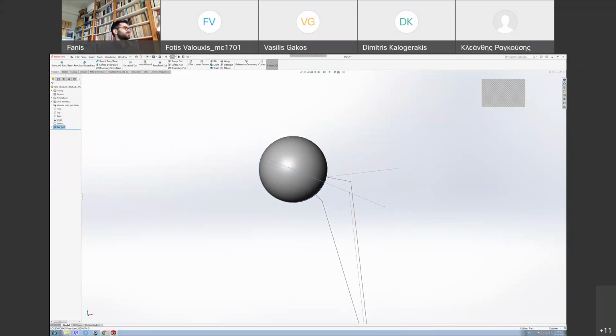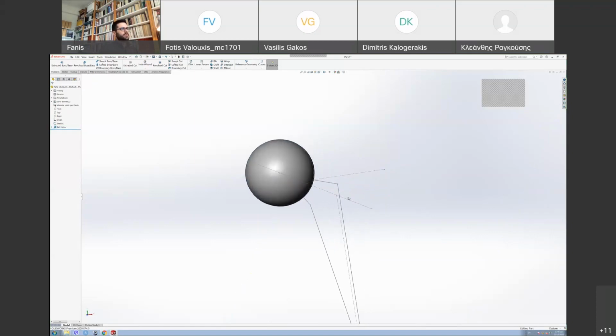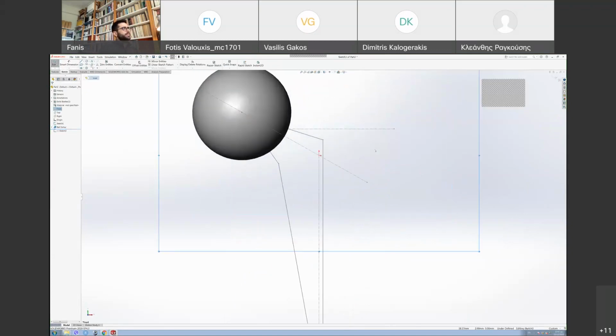Also, a good practice, if you're sharing your designs, is to rename them. For example, instead of leaving revolve, we can say that this is the ball, or the femur ball, or whatever. So when a new designer comes in, or when you're looking at your designs after a long time, you can pretty much remember what is which. And now again in sketch, we're gonna make the handle, let's say, or the rest of the bone. Again, go to the front plane, sketch. Let's bring it vertically.